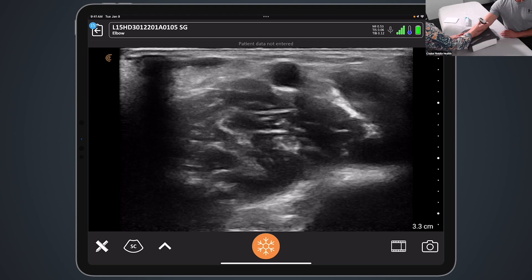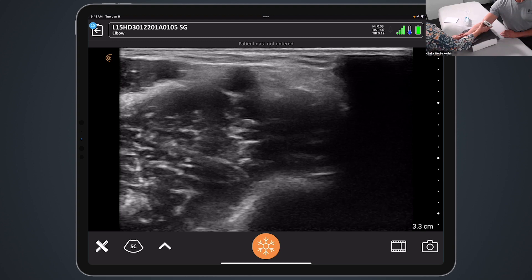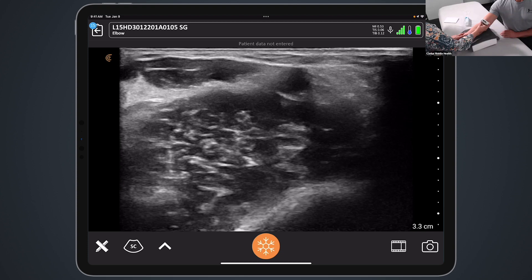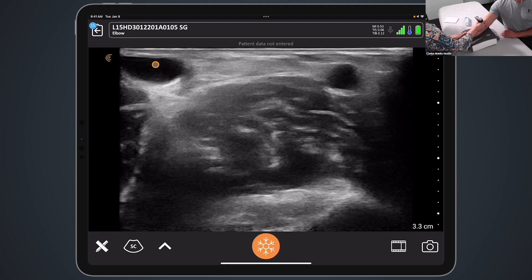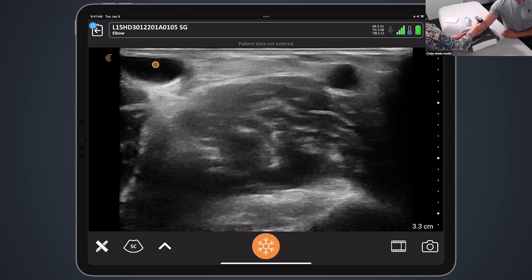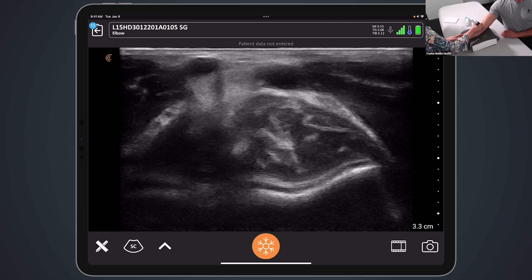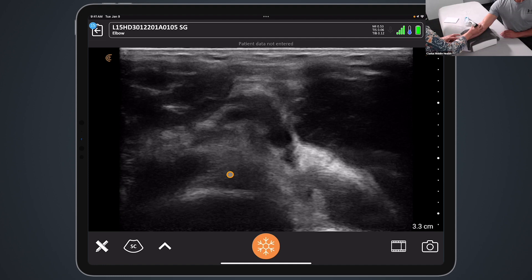To look for the lacertus fibrosis, it's important to keep the brachial artery in the middle and then move a little bit more to the left of the screen. The pronator teres muscle will be visualized, and on top of the muscle belly you can see a hyperechoic line — that's your aponeurosis. If I focus back on the biceps tendon and scan distally, I can follow this tendon, though it does require a little bit of toggling to avoid the anisotropy. It is tricky — it dives deep, and the further down I get the more challenging it is.